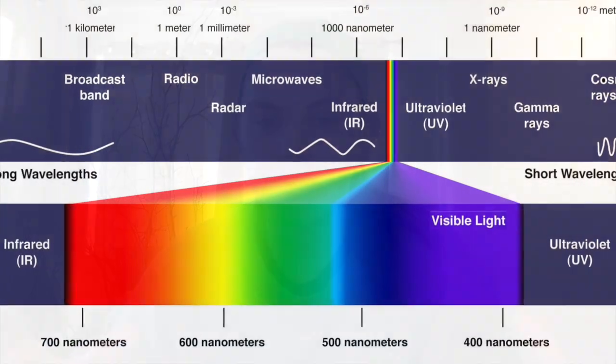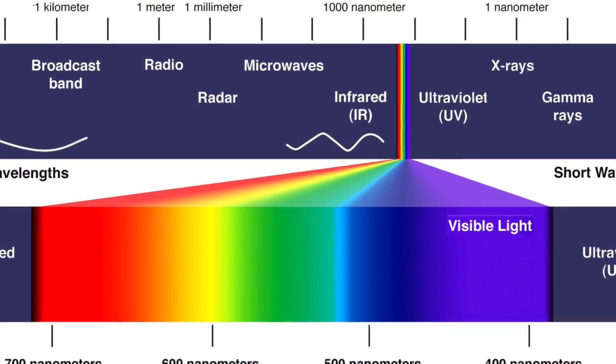Okay, so let's talk about x-rays, how the x-ray itself is formed, and then also how the x-ray image is formed. Radiographs are the fancy name for x-ray images. And x-rays are a form of electromagnetic radiation. They have a very short wavelength, high frequency, and high energy. You might have seen something like this from your middle school or high school textbooks.